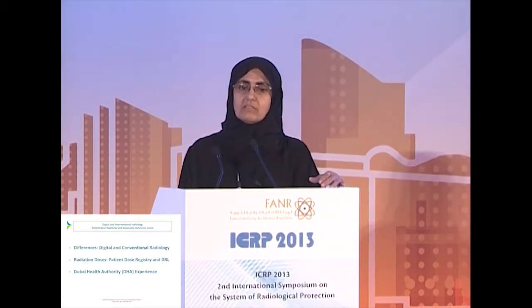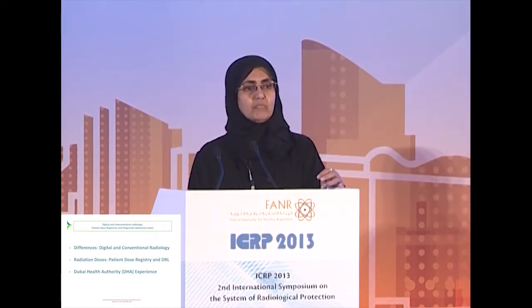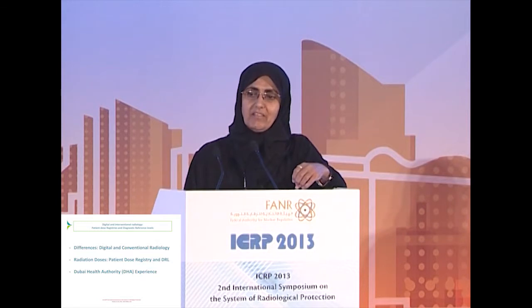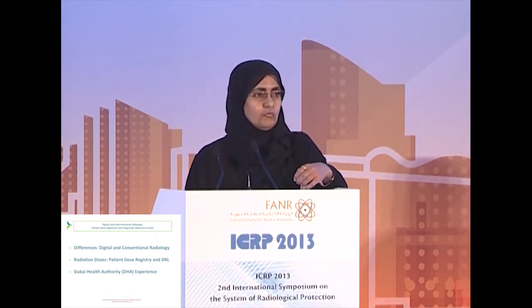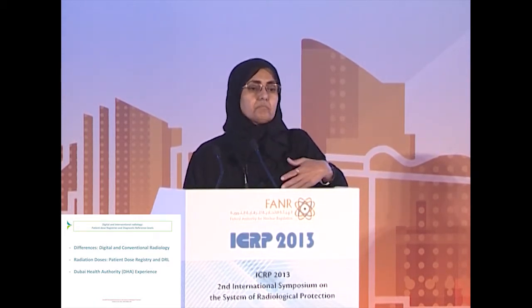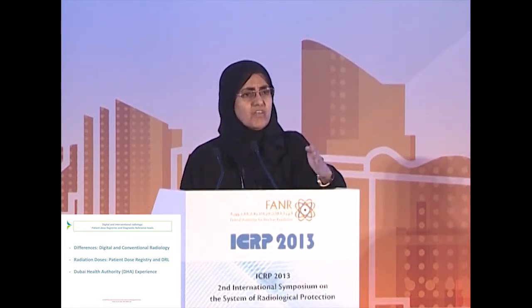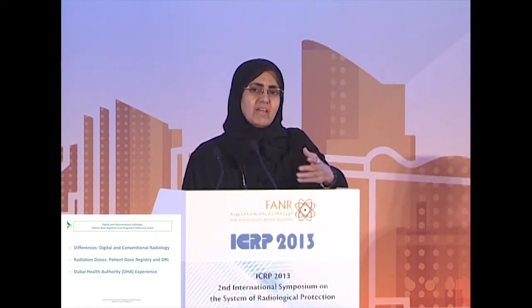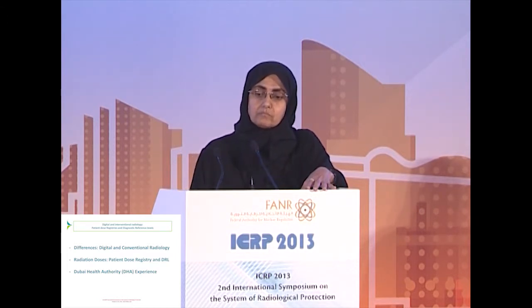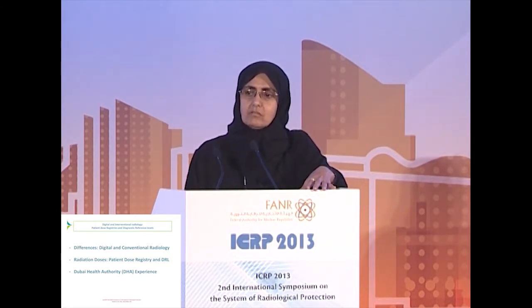The advantages of digital radiology over conventional radiology are tremendous. This is mainly related to the advantage of having wide contrast dynamic range, the possibility of post-processing functionality, and also the multiple image viewing options. Also, which is very obvious with digital radiology, is the transfer of the images electronically and the archiving possibilities within mainly the PACS system. This has introduced tremendous advantages in dose reduction.